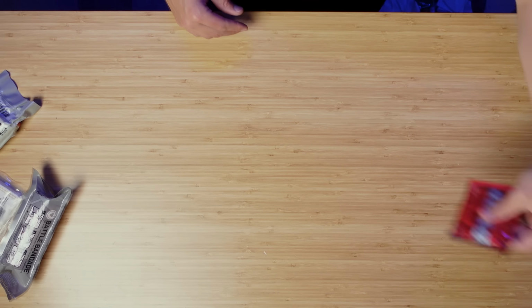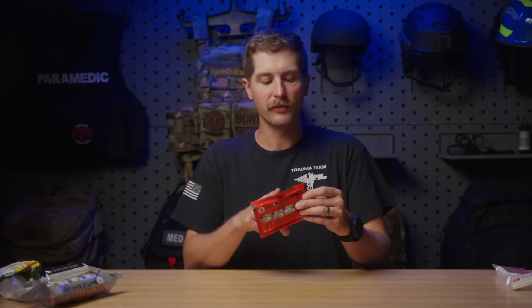All right, next up, we're gonna look at the Celox Rapid Ribbon. Now, I did some commercials for these guys. There's a lot of different Celox products, but this is one of their hemostatic agents, and they're all gonna open relatively the same.